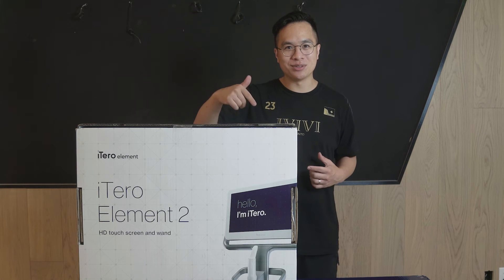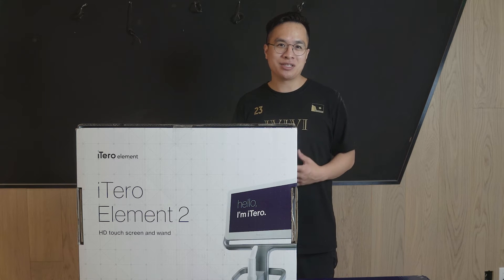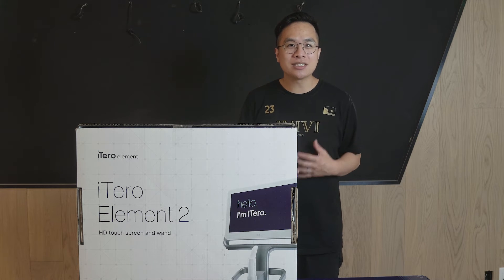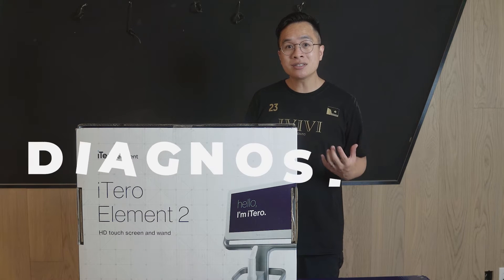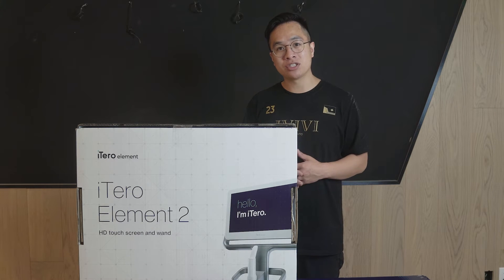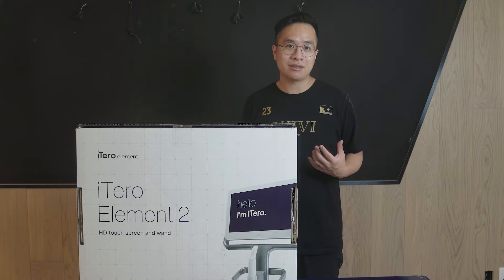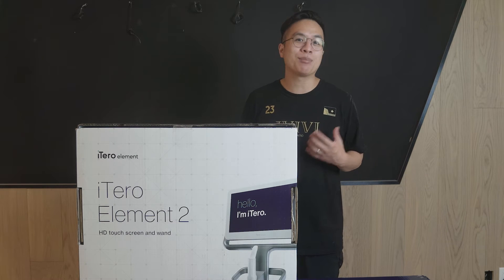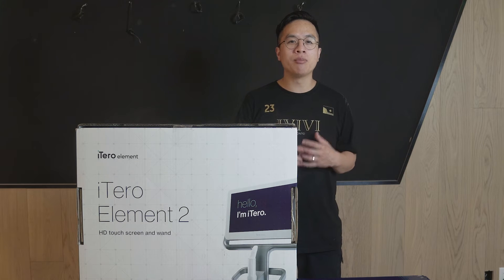We have a good unboxing here for you today — we're going to be unboxing and assembling a brand new iTero Element 2. Intraoral scanners, or IOS for short, are able to elevate patient care and it's a game-changing tool for the modern dentist. IOS allows us to create 3D renderings of patients' teeth. Some uses include diagnoses — for example, we can track wear or even movement of teeth using the time-lapse feature, orthodontic treatment using clear aligners like Invisalign, and restorative dentistry like crown and bridge, so we don't have to take those goopy messy impressions anymore.